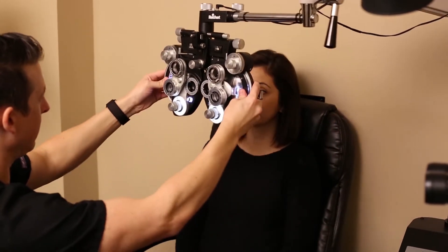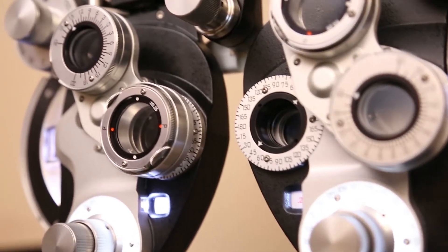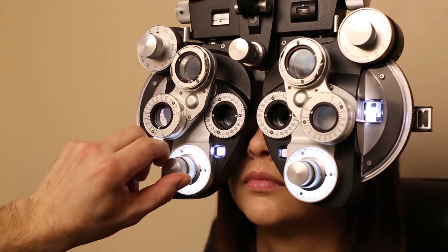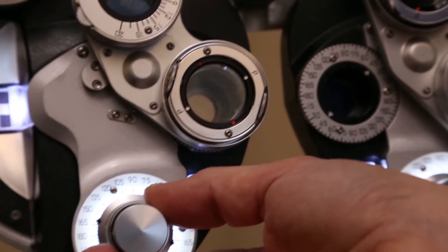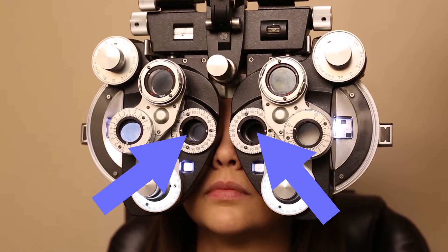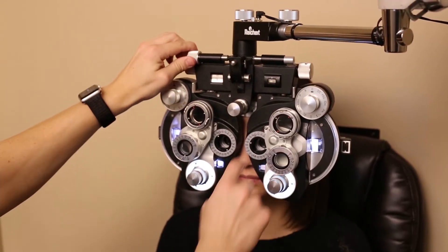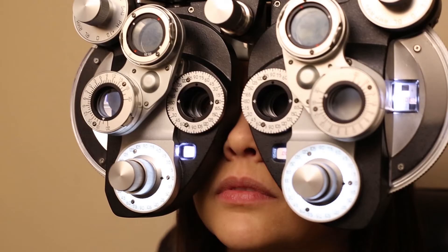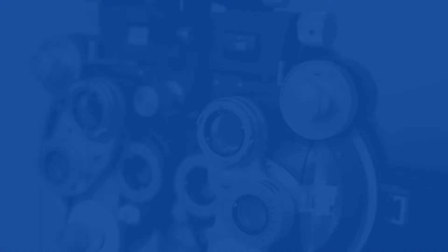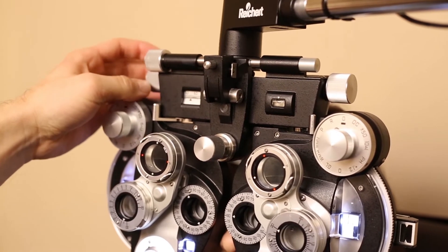To figure out someone's prescription for glasses, we need a phoropter. This is a phoropter. It was invented a hundred years ago, and it's so good at figuring out a glasses prescription that we still haven't figured out a way to do it better. It works if the setup is set up right. The patient's head needs to be even, and their eyes have to be looking through the middle of these openings. People have different sized heads, so the distance between the eyes varies, and that's called the IPD, or the interpupillary distance. You turn this knob to get the right IPD so their eyes are centered.